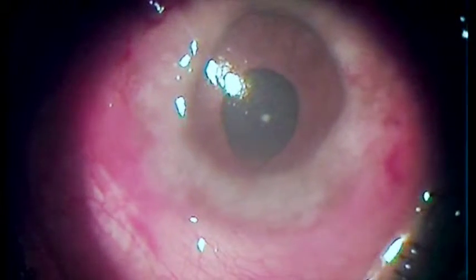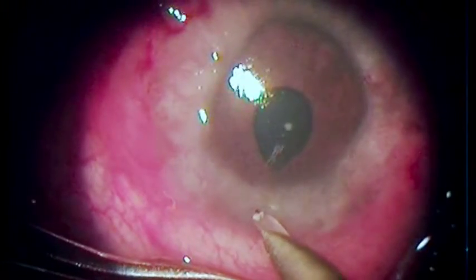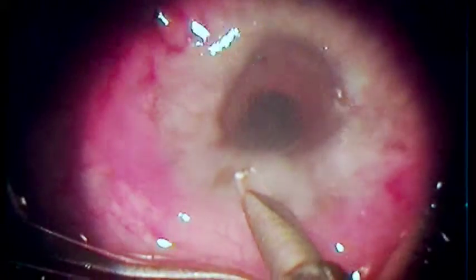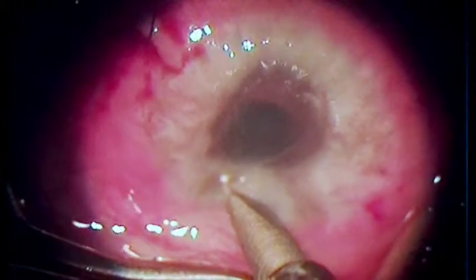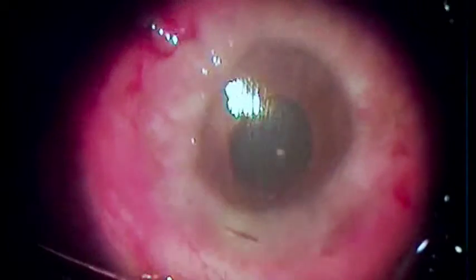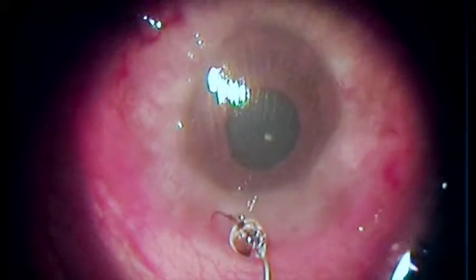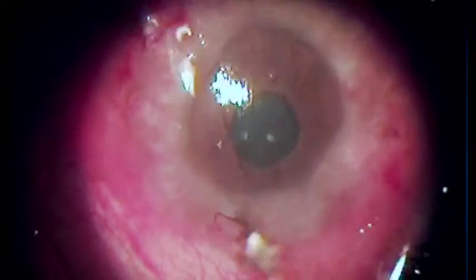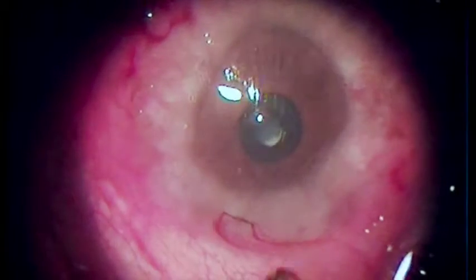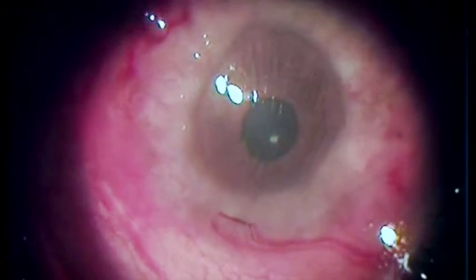Now we have to do a peripheral iridectomy, and in this case we have to go through the allergic masses, through the cornea into the anterior chamber using a tri-facet 1.5 mm wide knife. It is not going to injure the iris because of the softness of the eye — there has to be some resistance before a diamond knife will cut.